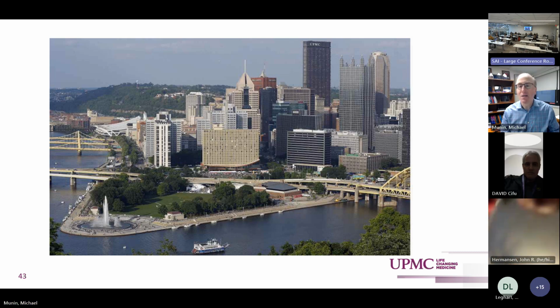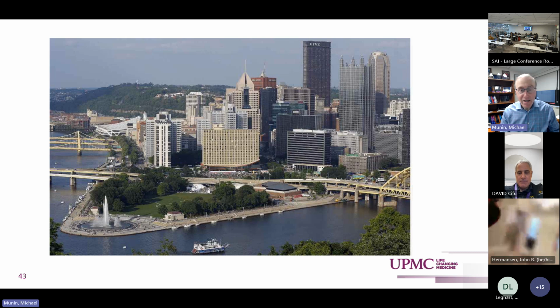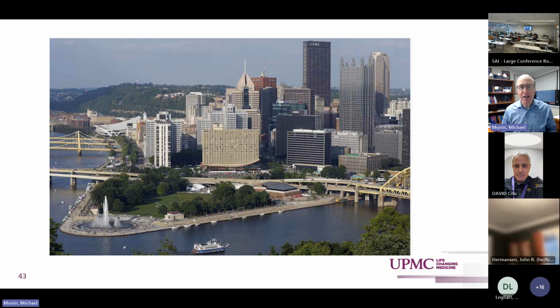Let's see here. Yeah, I've got a few questions in the chat. Do you still use EMG guidance in any cases? Yes. Great question. So here's where I don't use ultrasound. I have some adults with CP that have kind of a ballistic type of tone, when they're flailing their limb, or they have so much spasticity, tremendous spasms, or patients with low tolerance for the procedure. You've got to be quick. In all of those cases where you've got to be quick and there's just not the ability to sit and analyze the muscle, EMG is my friend for that.